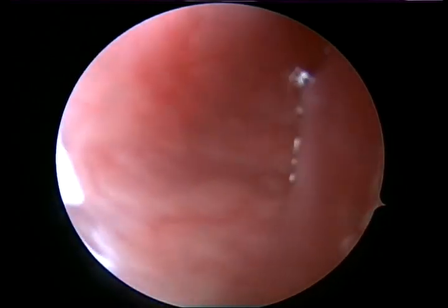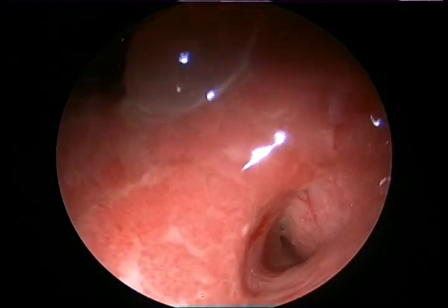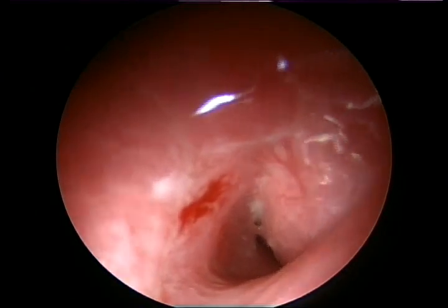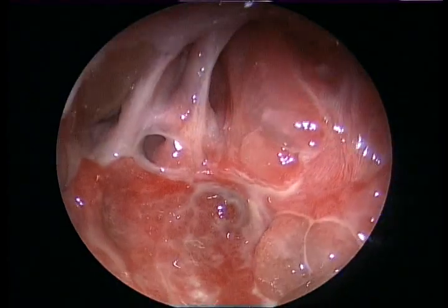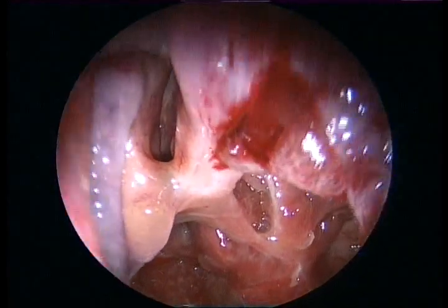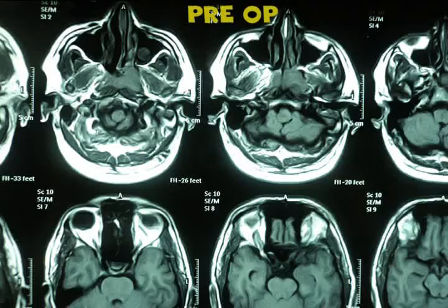In a nasopharyngectomy, we cut the cartilaginous portion of the eustachian tube flush with the skull base, where it joins the bony portion. When we use a 70-degree telescope and rotate it towards the skull base, you can see the whole skull base. The posterior septectomy has been done.